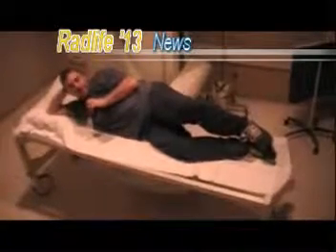I'm here on the X-ray table that comes with the Indico 100 series. It's a nice comfortable table, holds up to 350 pounds. It can move in 4 directions, or from head to toe with the flip of a couple foot pedals. It's convenient in that if the patient can't get on the X-ray table themselves, we can move it out in the hallway and put them on this table and wheel them right in.